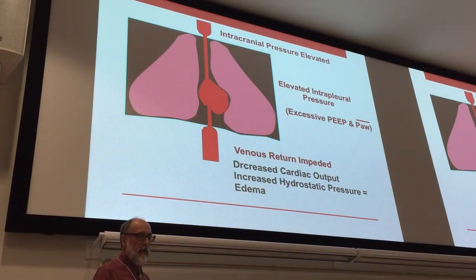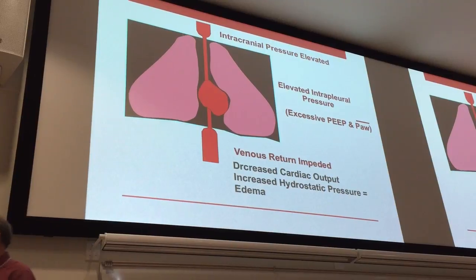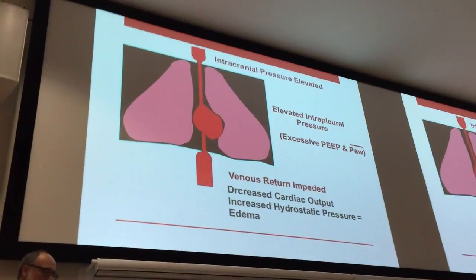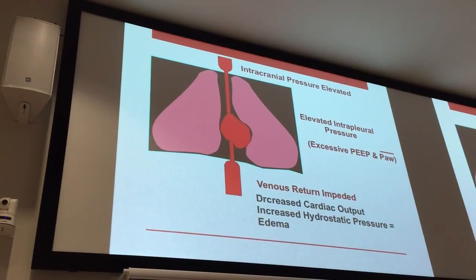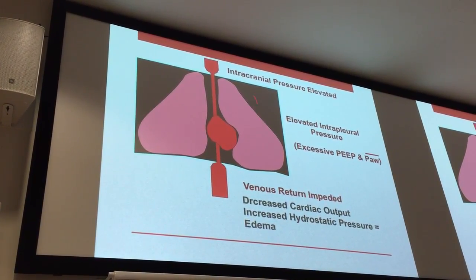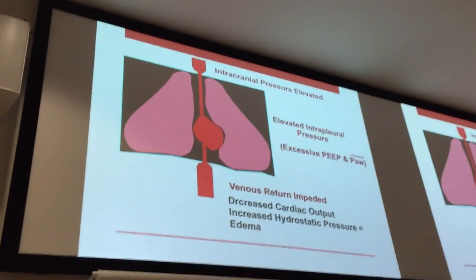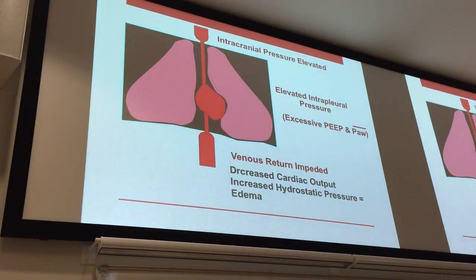And this is one of the many slides I have, to various degrees, plagiarized from Evan Richards, who is a great artist who has done a lot for the education of the neonatologists and respiratory therapists over the years. But what this illustrates simply, and of course I always change things, but he'll recognize it, is that when you overexpand the lung, this is not the latest version. So I changed this. Oh no, elevated intrapleural pressure, that is correct, I'm sorry.